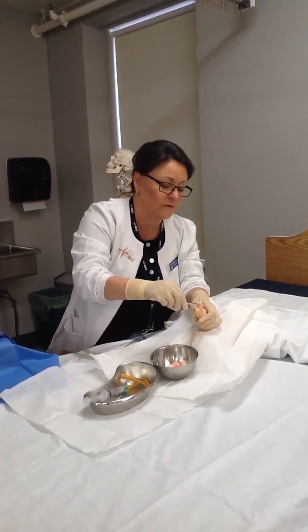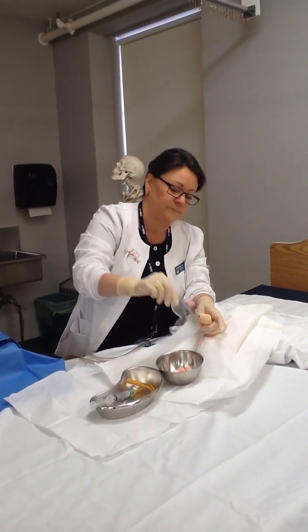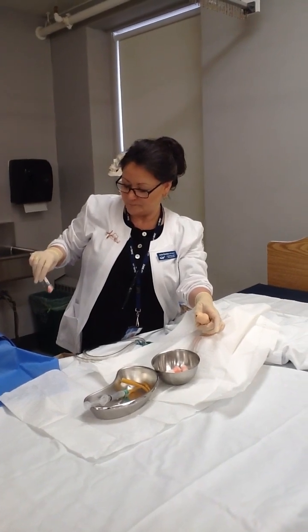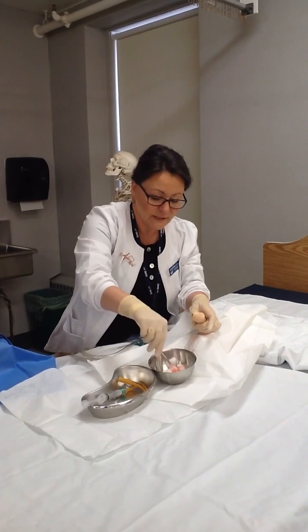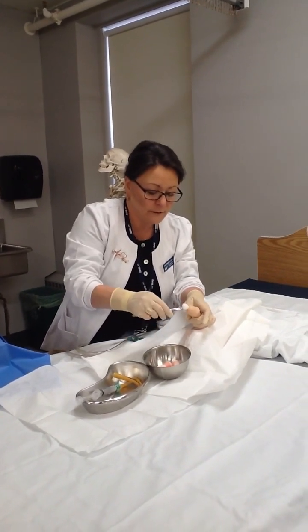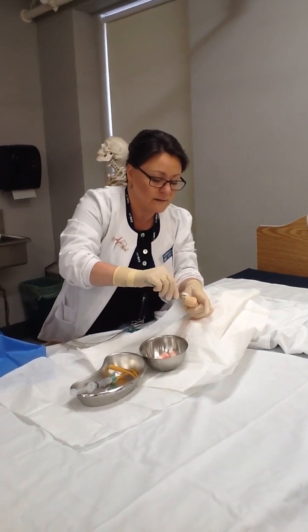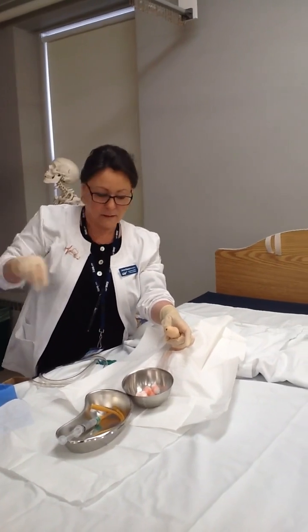We never go back over that area, all the way down the glans. And one more, right in the center and all the way down the glans. Drop that in, and we're done with that.